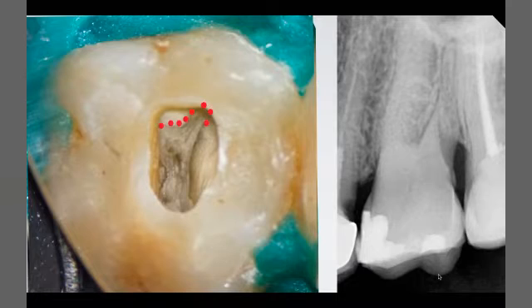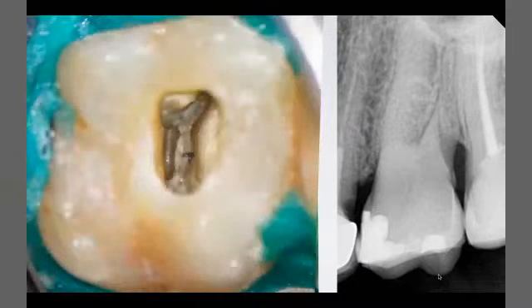So with magnification, in this area, exactly in this area, you can see the bright dentine. With ultrasonic tips, you have to break up these calcified tissues slowly, dry, re-evaluate, and then go again with the ultrasonic tips.